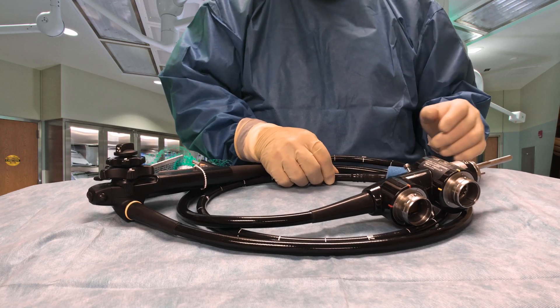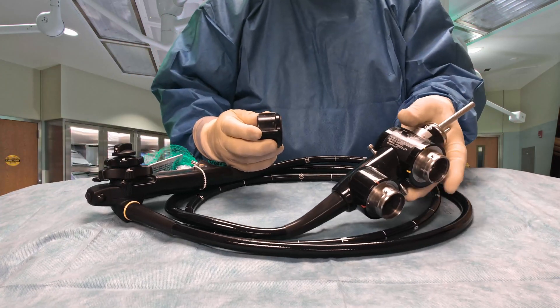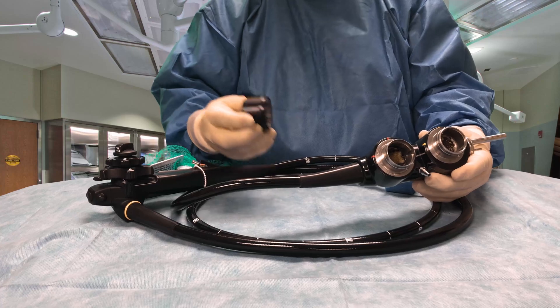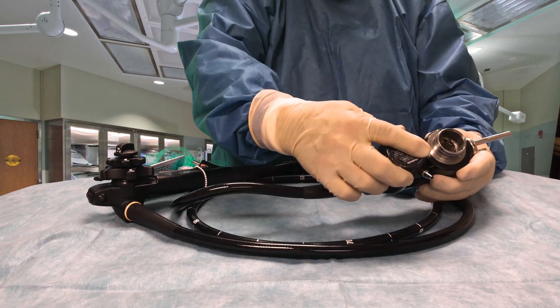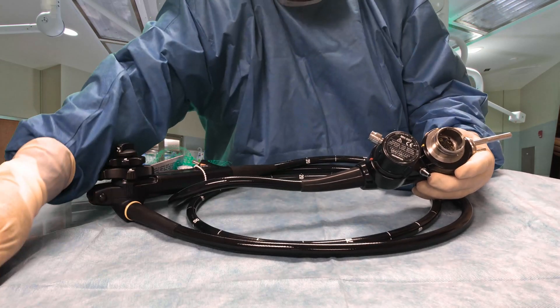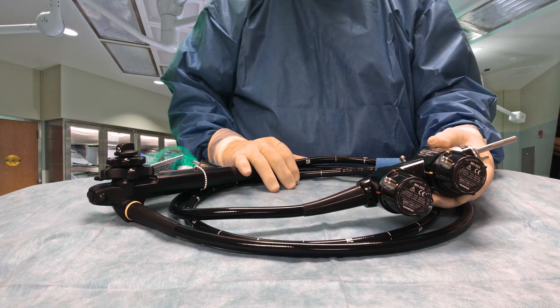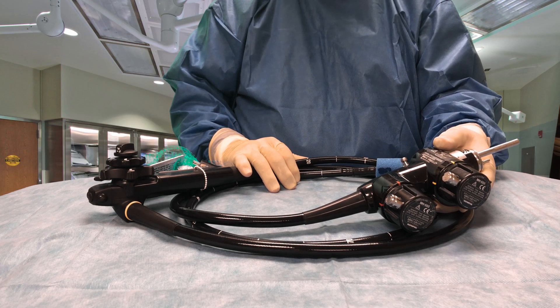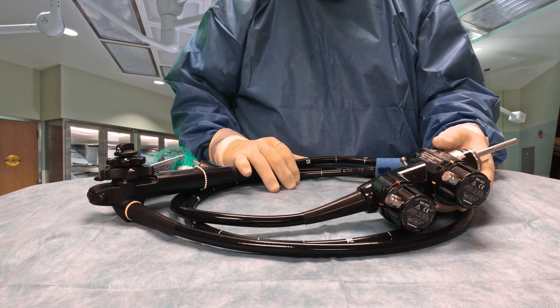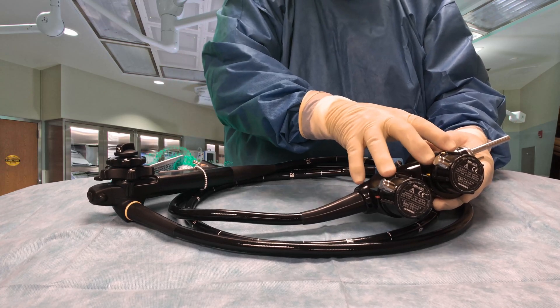When we're done using this scope, we go through the cleaning process, which we'll go through later. These waterproof, water and air resistant caps will go on to the scope, and it'll be transported to the cleaning room where it'll go through a process of high-level disinfection. This also protects the electrical pins on the inside.